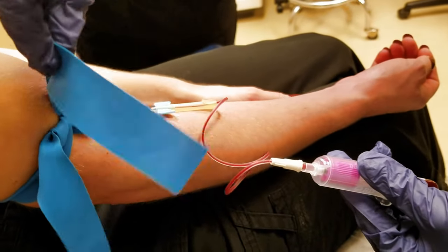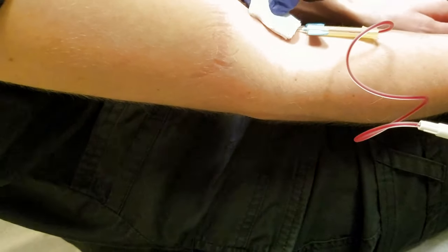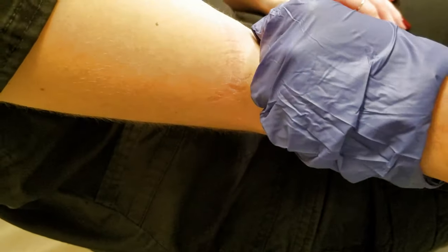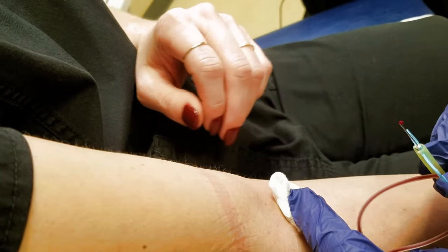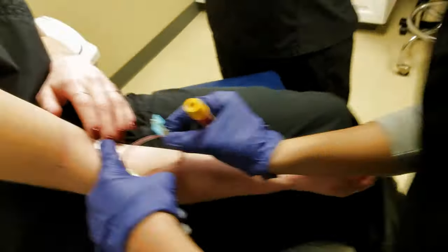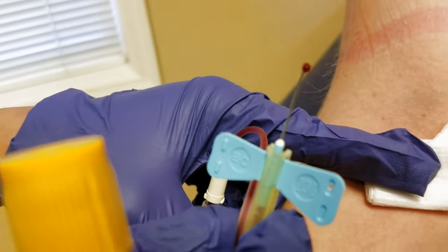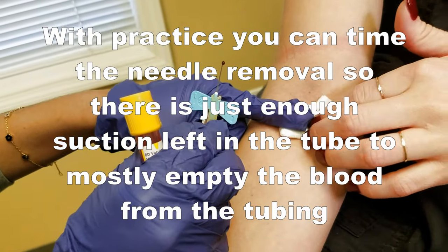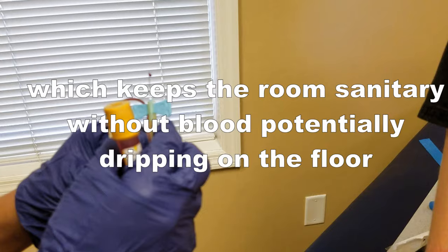Take your gauze and put it over the needle with your left hand, then take out the needle with the right hand. Now push down with the left. Because there wasn't enough suction left, there's a little drop of blood right there on the end. Go ahead and pull your thing down — push the yellow part down to protect the needle.